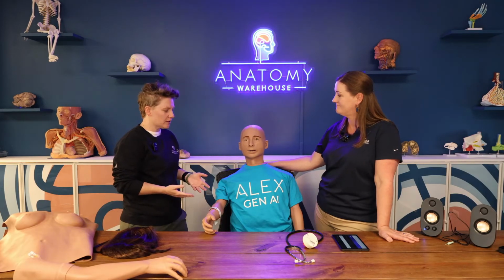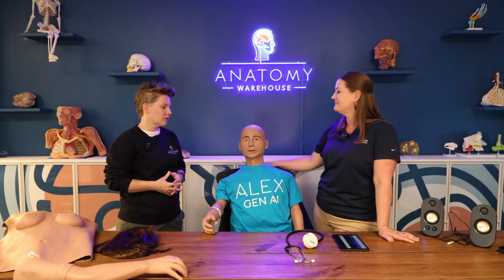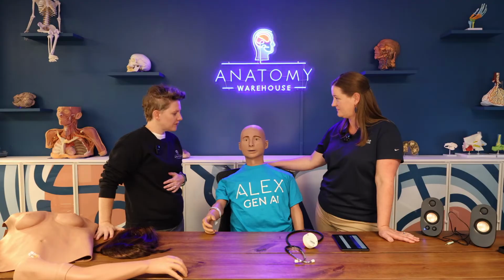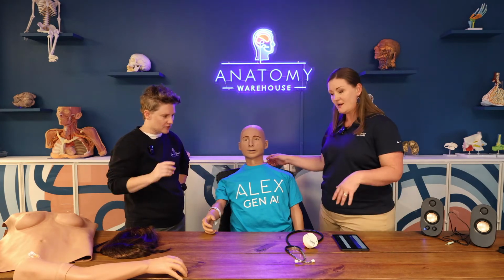But obviously, what is really exciting about Alex is the software and the generative AI, which I think is so cool. So why don't we just have some fun? How do we want to kick off talking about the software? I see a couple of items here. So walk us through what we've got.